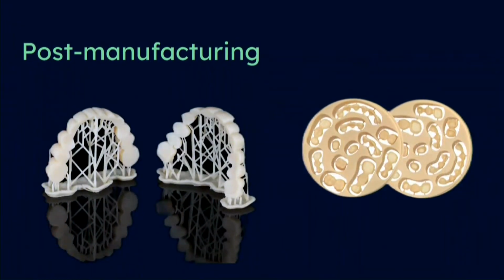Post-manufacturing is like the dirty secret of dentistry. It is what no one talks about, yet it is very important to deliver the prosthesis or appliance that demonstrates the physical properties that it's meant to have. The left image shows printed denture teeth. Printed prostheses are mostly made out of resin and need specific post-processing work, which involves alcohol washing to wash the outermost uncured layer of resin.